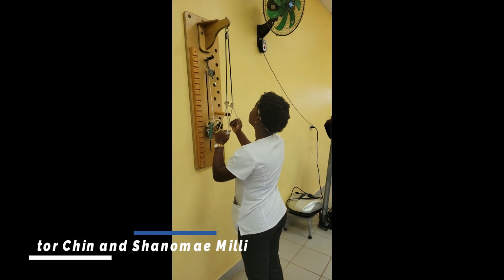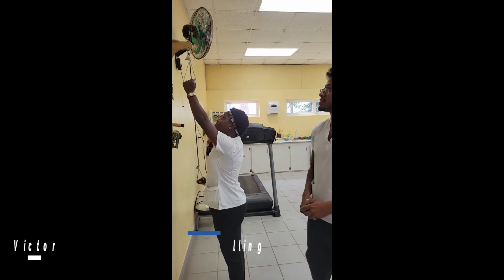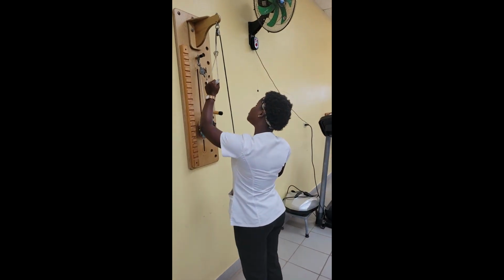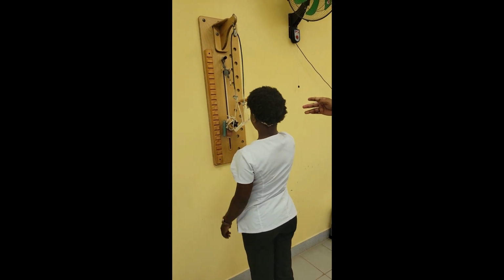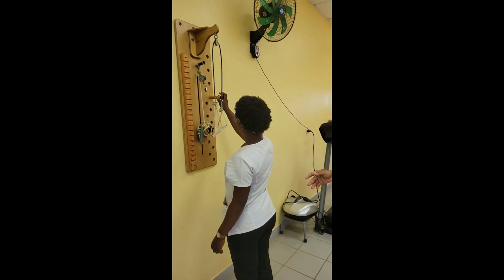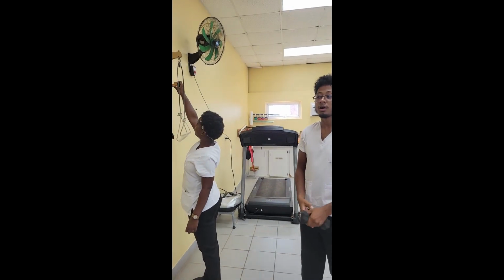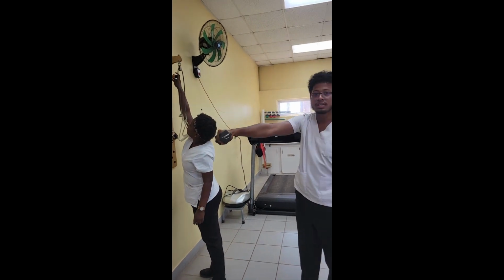So this morning we had a patient with a rotator cuff injury. This is the apparatus that we set up so that she can increase her range of motion. Also, she had difficulties elevating her arm above the level of her head, so she used the same apparatus to guide her in elevating her arm above her head. Also, she was doing some dumbbell flies so that she can strengthen that rotator cuff muscle.